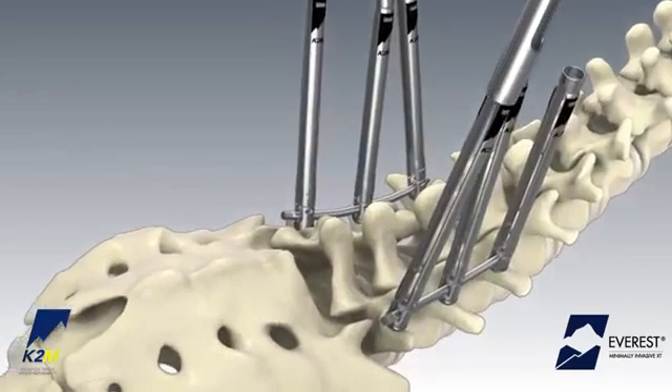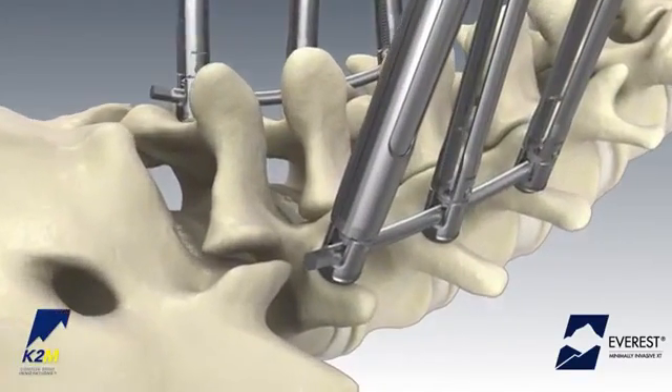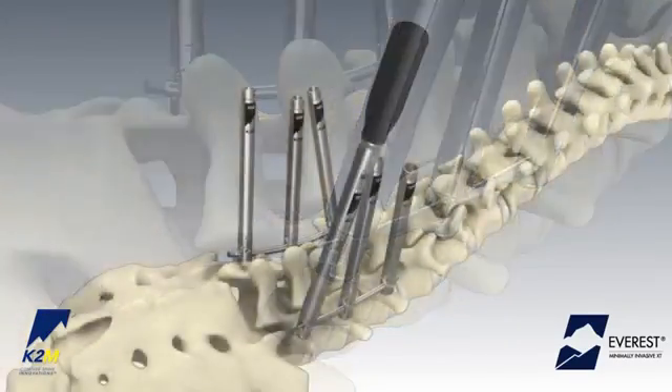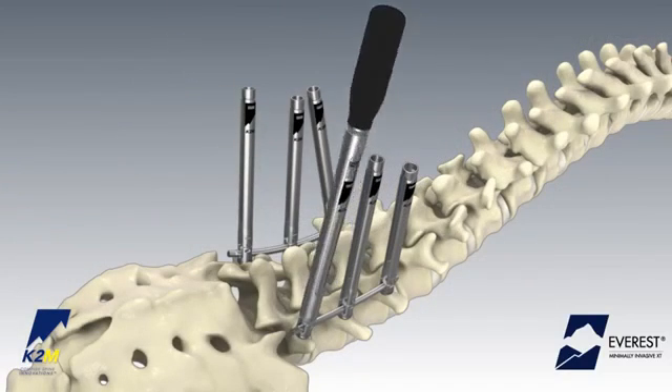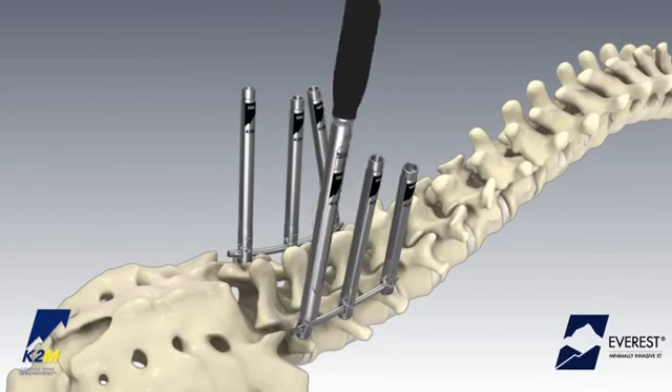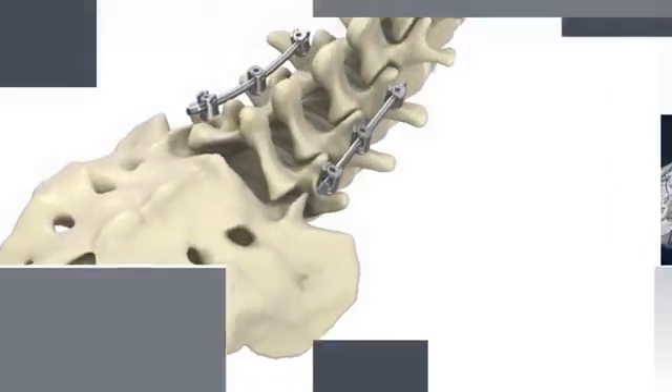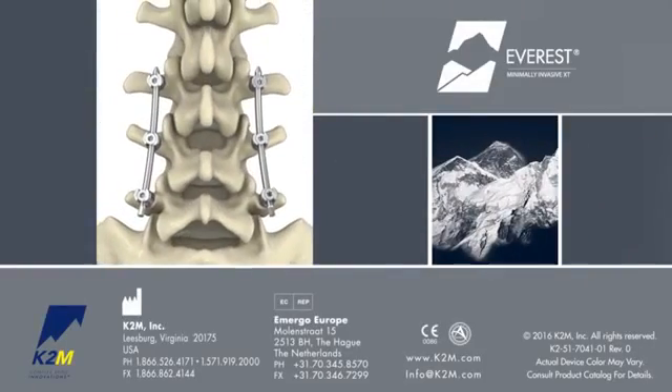Slide the removal tool over the XT screw until the distal tip of the instrument is flush with the top of the screw head. Break the tab off aggressively by rocking the instrument back and forth until the entire tab is fully detached from the screw head. The Everest MIXT Spinal System from K2M — Complex Spine Innovations.